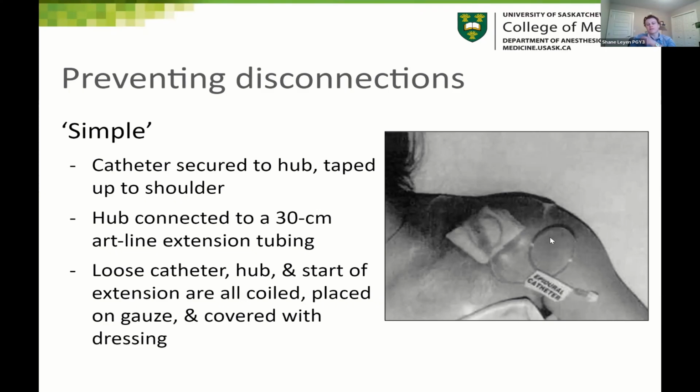The reasoning being that this then protects this entire hub component from contamination, and that if or when boluses are being given or the bag is being changed, there's much less force being applied directly to the hub, such as anytime we give a bolus, we disconnect things and we're yanking on stuff. So this would definitely require a bit more time involvement from nursing colleagues, as well as getting a lot more equipment up to obstetrics if we were to implement something such as this.